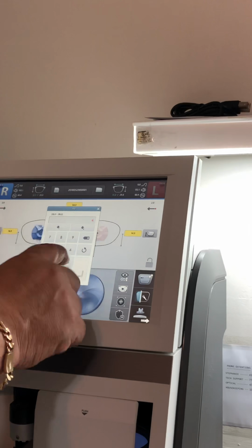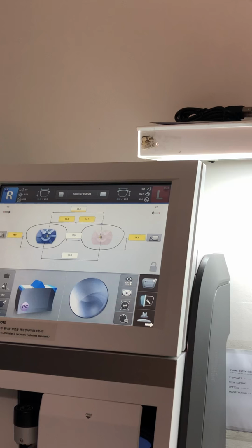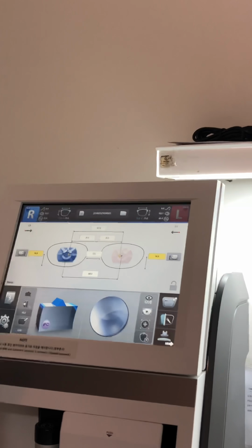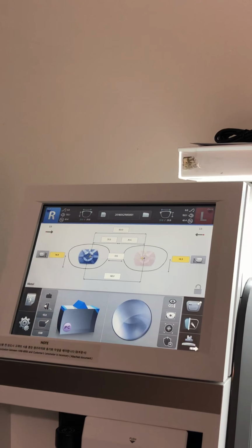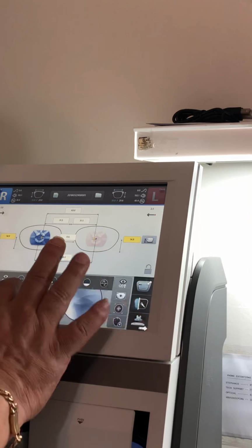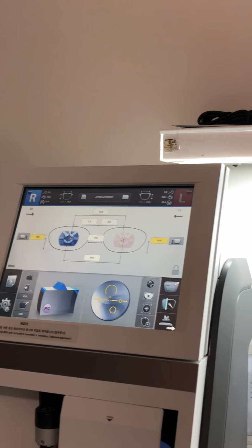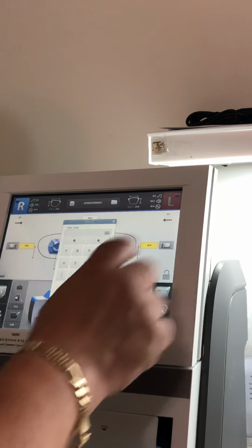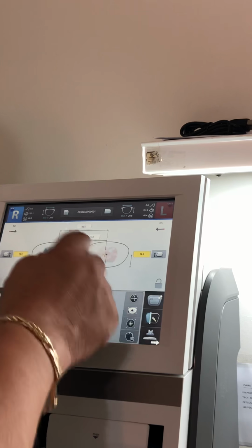Like 62, 63. Okay. If you have mono PDs, do y'all do mono PDs over there? Yes, for monos, progressive, especially for the progressives. Say we're gonna tell this guy it's a progressive, okay? So you're gonna have your mono PDs. So right here you'd have, say on the right it would be 29, and on the left it'd be 31.